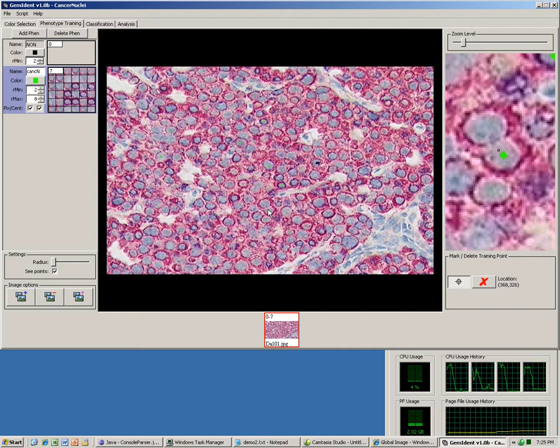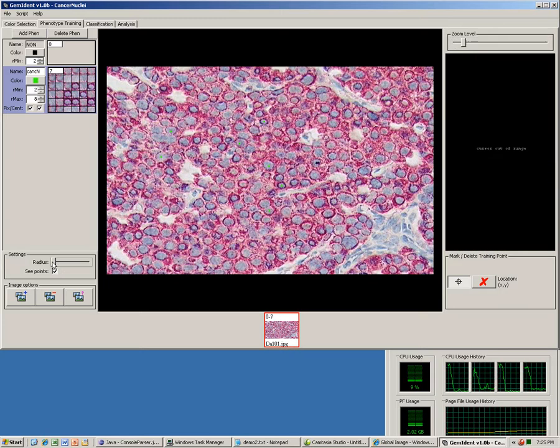We can do that by adjusting the Rmax value. Notice the helper display image gives small examples. I think a size of 13 is about right.